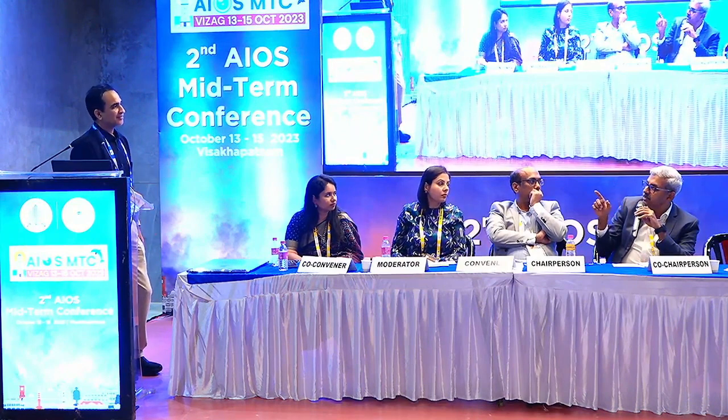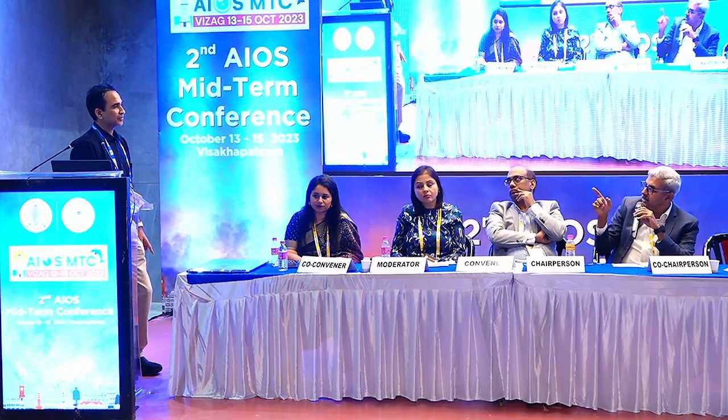So what I can potentially understand is that your OPD acquisition is not using the figures from the Verion OPD module. You're probably using different biometer readings and feeding those into the Verion and using those axes. No, I'm trying to say that the Verion has asked him to implant a lens at 170, he's implanted at 170, and post-operatively somebody else has seen the lens isn't at 170.